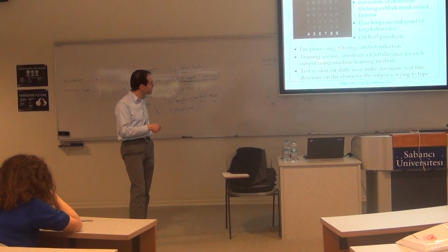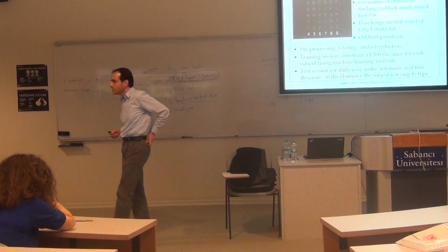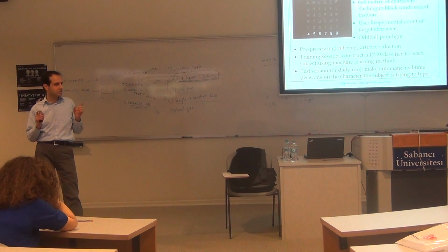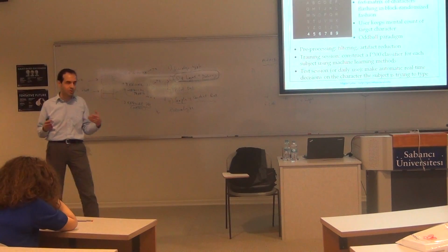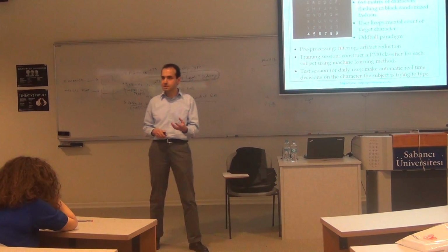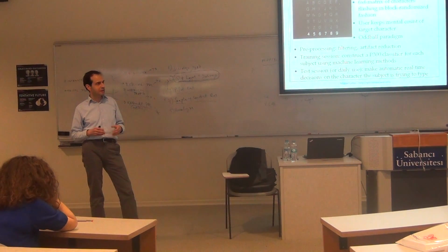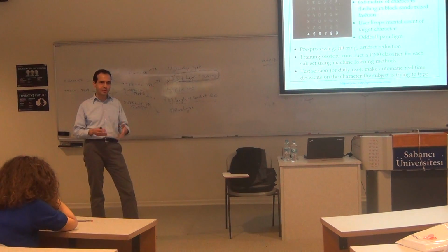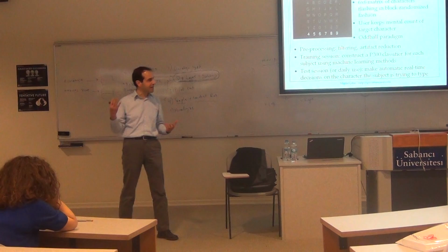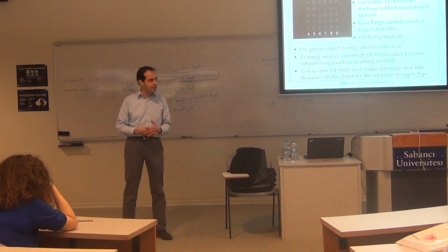So what you do is, you have a training session with each subject for something like 10 minutes. In that training session, you give the subject a known word to type. So you know the truth, essentially. You know what the person is trying to type, which means you know where the P300 signals should be generated. So that's called labeled data. That's supervised learning. You are teaching the system how the person's brain signals behave. That's training for our algorithm, not training for the subject.